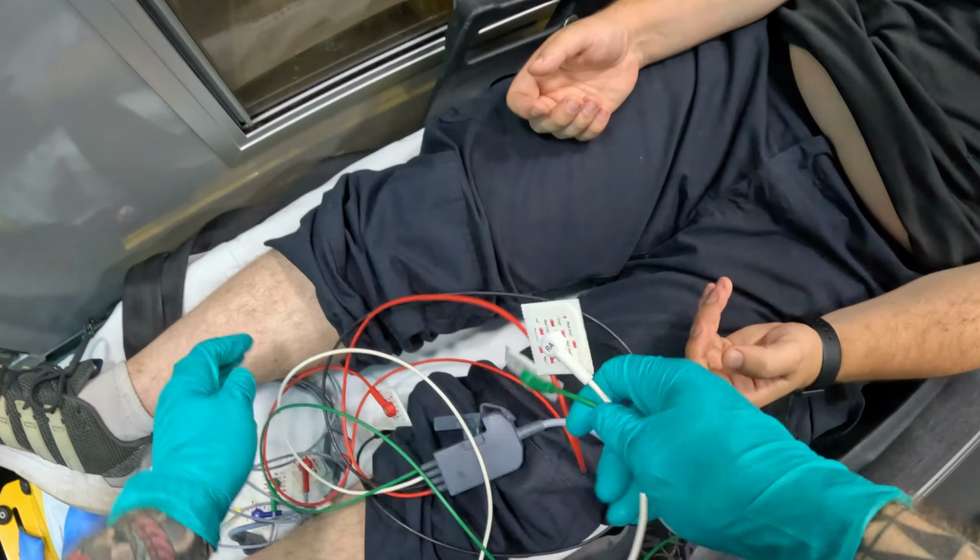And then what you want to do is click print right here at the bottom. What I'm printing is his basic rhythm strip. This is your three lead rhythm strip. So once I've got the rhythm strip here, I click print again, and I'm done. I want to do the 12 lead now.